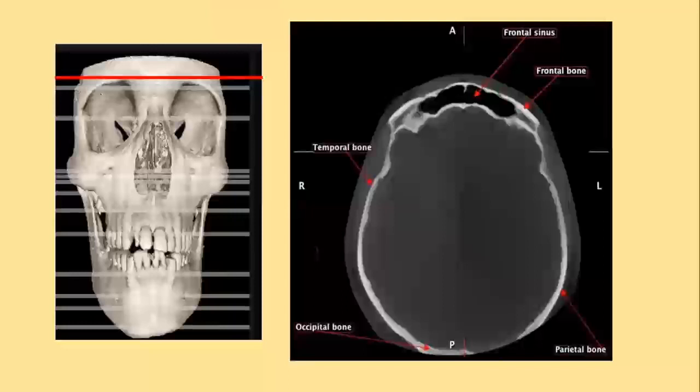So if you have to go through these landmarks quickly, that's the frontal sinus for you. Look at the plane where I am. Now this is the axial section, right? So I'm going to work down from top to the bottom. And as dental surgeons, we are really experts of the mandible. There's nothing much to really choose from. But at the maxilla level, the mid face, there are some landmarks we all need to know.